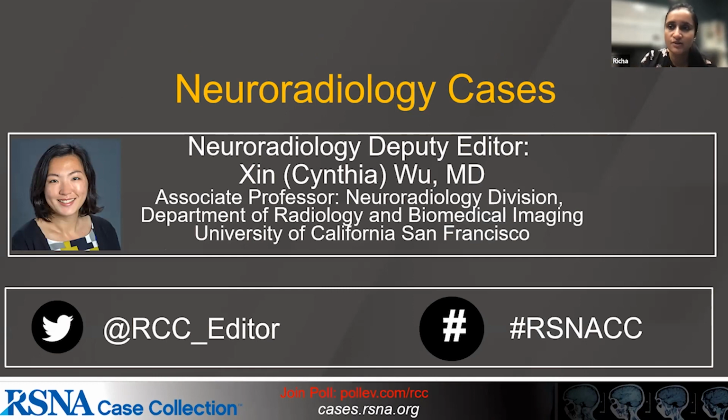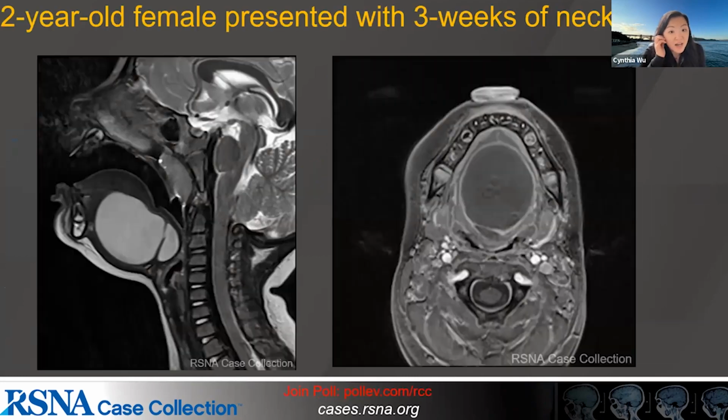Thank you so much, Dr. Hosseinzadeh. That was great. Our next speaker is Dr. Cynthia Wu, who's Associate Professor of Neuroradiology at UCSF, and she'll be reviewing some interesting neuroradiology cases. Thanks, Dr. Wu. Thank you so much, and thanks again for attending our session. And let's move on to some neuro cases.